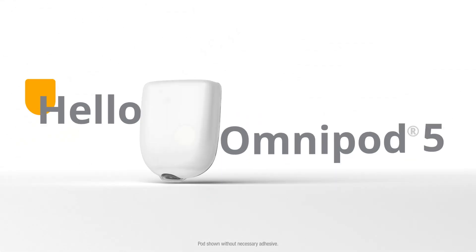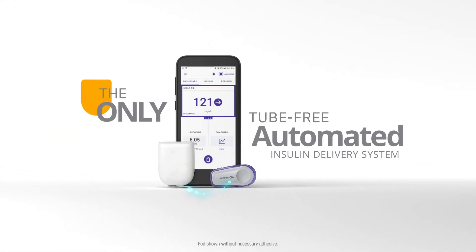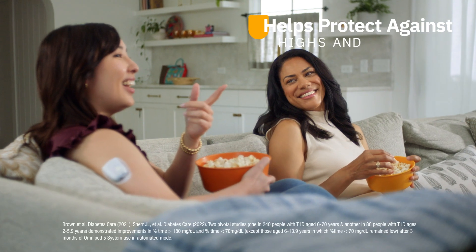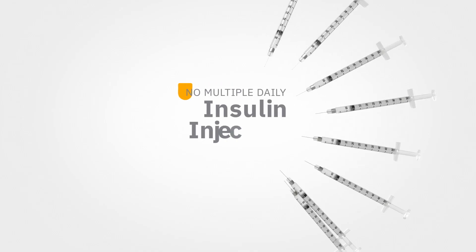Say hello to Omnipod 5, the only tube-free automated insulin delivery system that integrates with Dexcom G6 and G7. Working together to help protect against highs and lows, day and night, with no multiple daily injections.